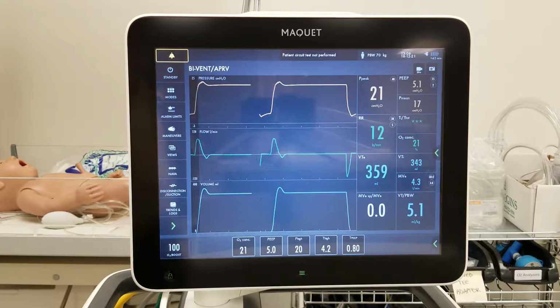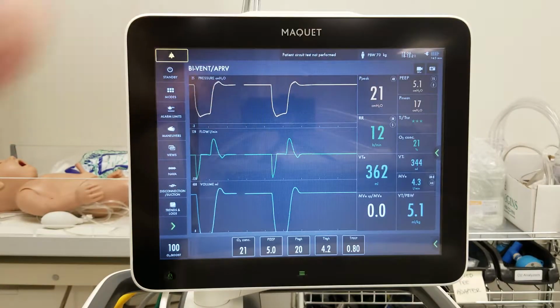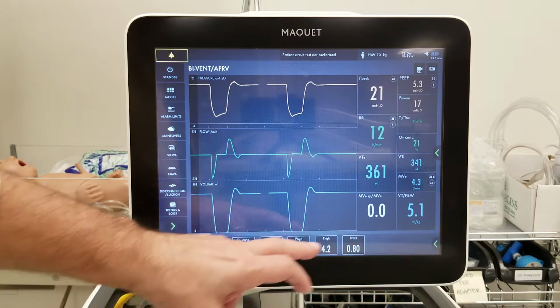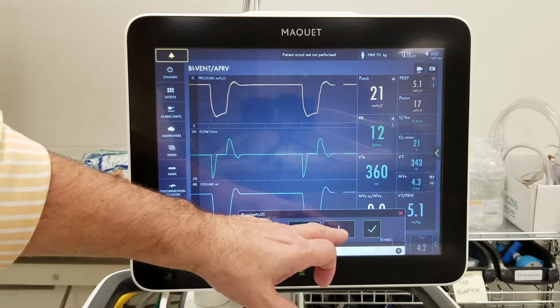Now this may be appropriate for a patient that is sick with ARDS, but notice our peak pressures are still well below 27, so we actually are going to want to get a larger tidal volume. Our target is 6, according to the best evidence we have right now.